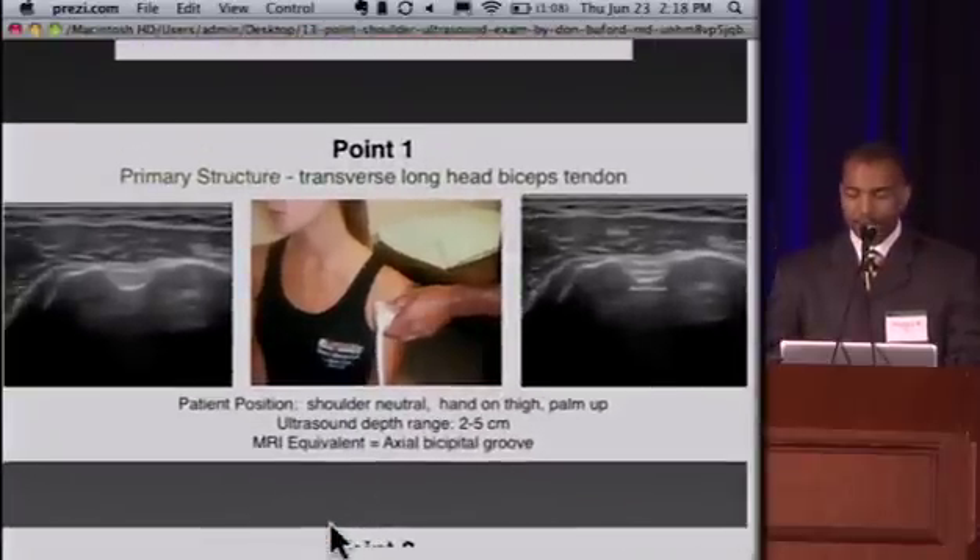At point one, we have a patient sitting on a stool in a darkened exam room. The transducer is oriented transversely along the anterior shoulder, centered over the bicipital groove. The biceps tendon is a hyperechoic structure sitting in the bicipital groove. Cortical bone is white, so this white line is the anterior humeral cortex, and the bicipital groove is outlined here. Medial to that is the subscapularis tendon. Deltoid muscle is up above, and the biceps tendon on its transverse axis sits in the bicipital groove. That's point one.